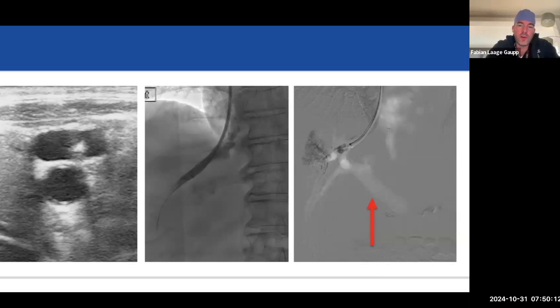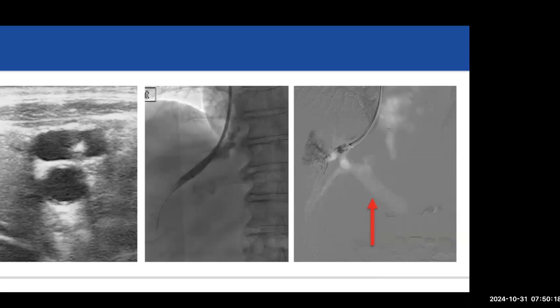Do you know how you can confirm if you're in the right hepatic vein? Yes, with positioning of my X-ray source, you can get a lateral image to make sure that the catheter is not going distally. However, it's coming towards the X-ray source.